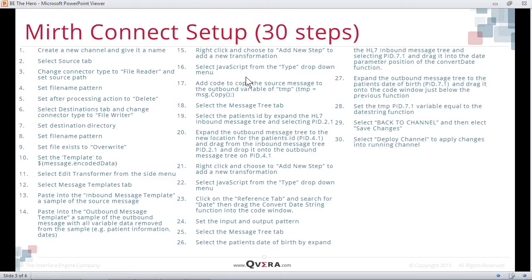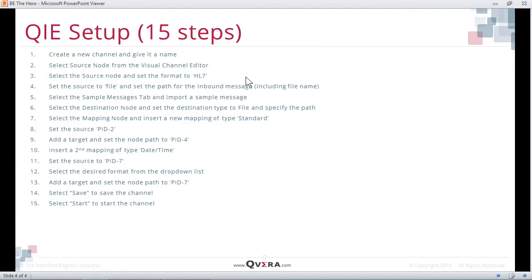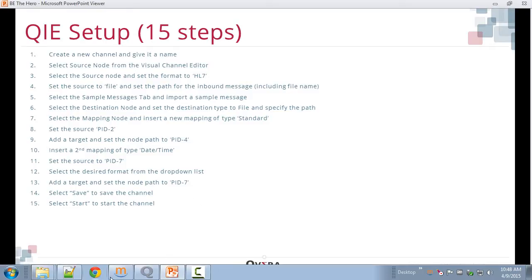As you can see, in Mirth this takes 30 steps to complete, and in QIE only 15 steps are required. We will now demonstrate the setup of both of these interfaces in QIE and in Mirth.